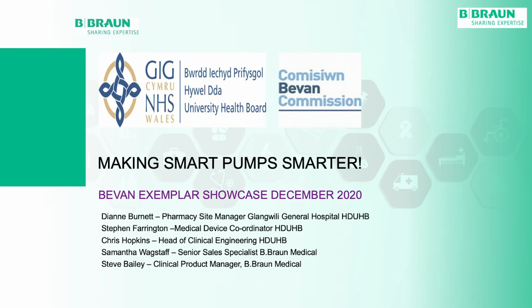So what we're actually missing here in Hywel is connectivity of these pumps to our Health Board network. If we had the infrastructure and the connectivity, we would be able to do these updates with the configuration and the drug library in a really good, timely manner, and maintain the safety of this drug library going forward. So what Bevan has allowed us to do is scope out what this technology could provide us, i.e. the connectivity, and what we can learn from the reporting that happens as a result of this technology. This presentation is to show you what we've learned so far and what we're going to do next, and hopefully we'll have a conclusion at the March showcase next year.